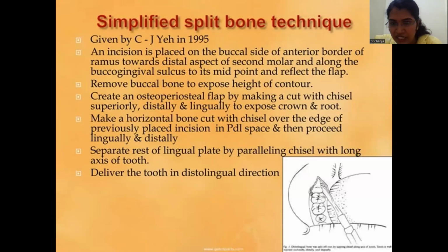Then proceed lingually and distally. Then you separate the whole lingual plate by parallel chisel, just like we explained before, and then deliver the tooth via the distal lingual direction.